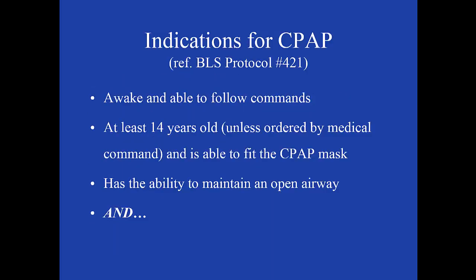So let's discuss some of the indications for CPAP. These indications are referenced in BLS protocol number 421. First of all, the patient must be awake and able to follow commands. They need to be at least 14 years of age, unless ordered by medical command, and they must physically be able to fit the CPAP mask. They also have to have the ability to maintain an open airway.